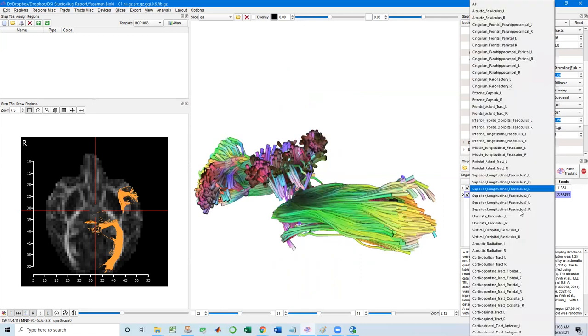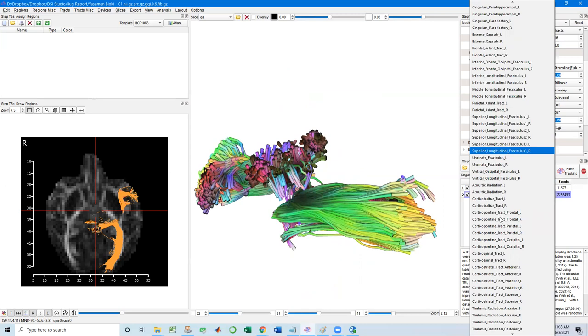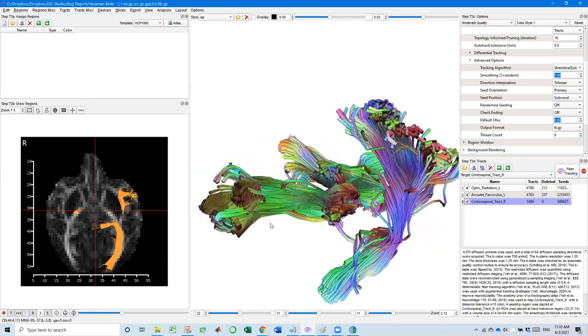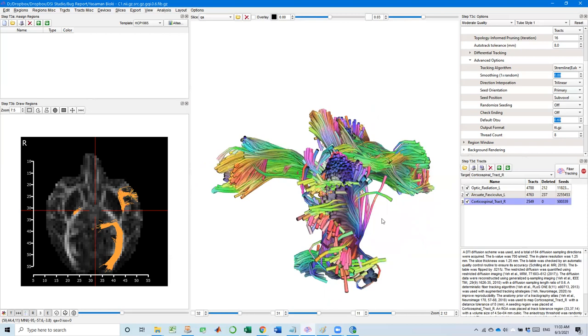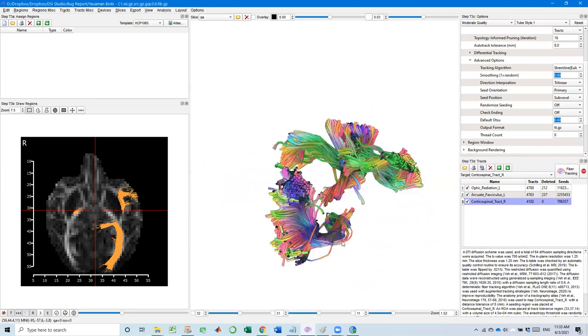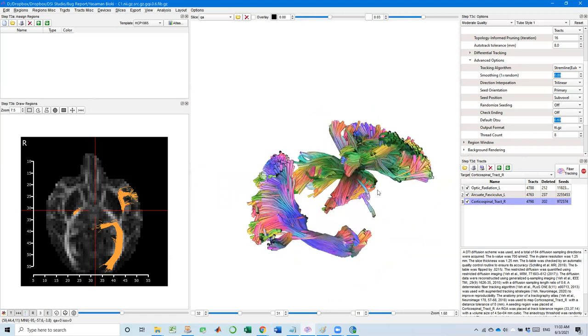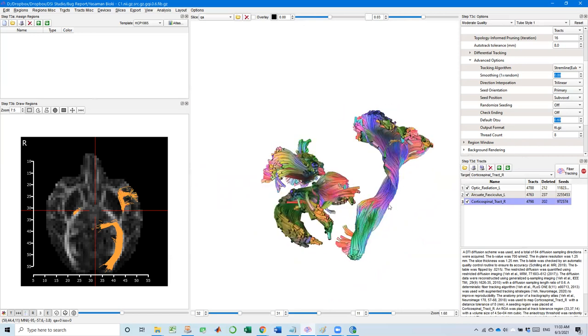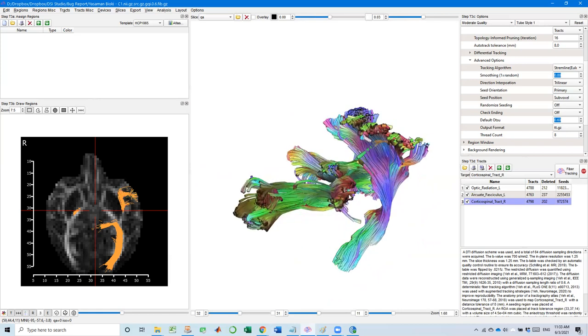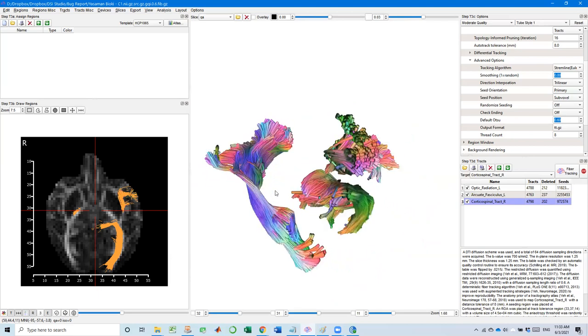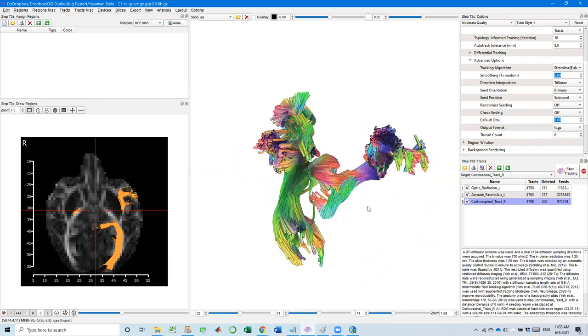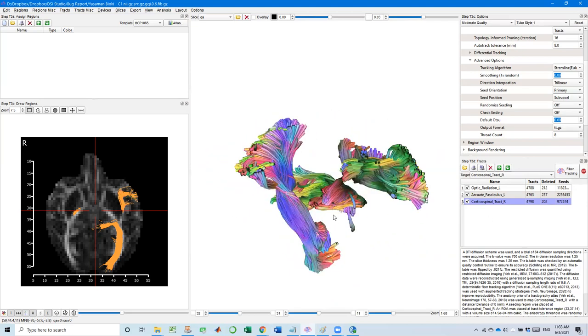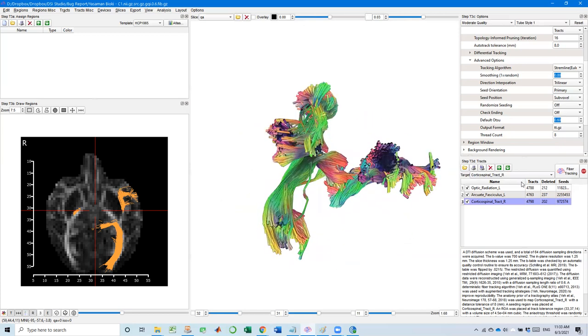Let's try another one. I'll say corticospinal tract on the right side. See on the right side, see if it goes well. Oh, it's actually pretty good. So one key feature in this auto track is DSI Studio doesn't need T1 or structural image. It's purely based on the morphology or geometry of tracks. So even we don't have T1, we can get the tracks match with the atlas. It's pretty nice.